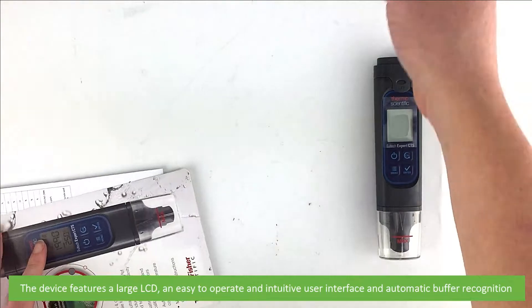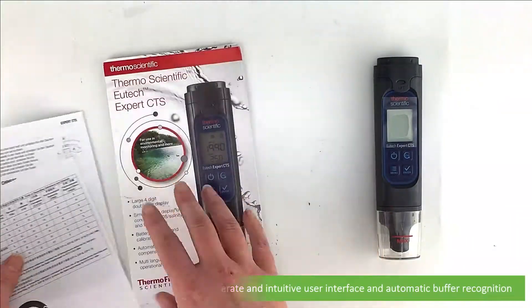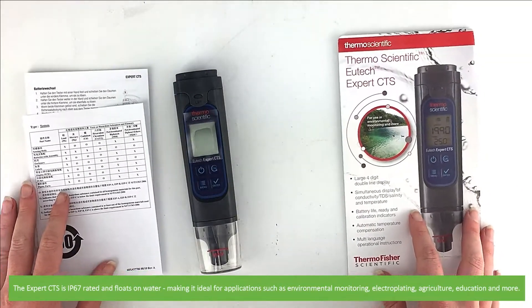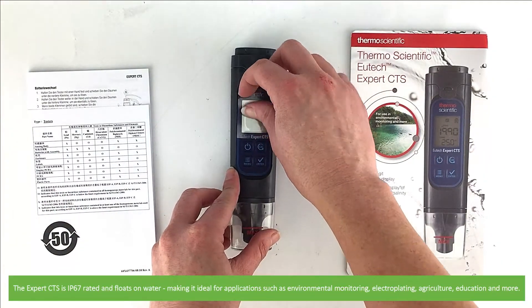The device features a large LCD, easy to operate and intuitive user interface, and automatic buffer recognition. The Expert CTS is IP67 rated and floats on water, making it ideal for applications such as environmental monitoring, electroplating, agriculture, education and more.